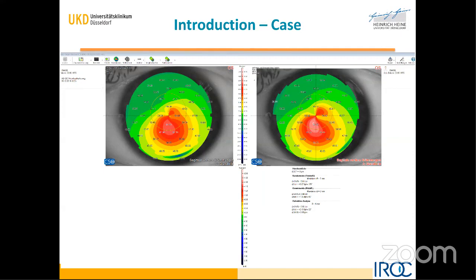So this value takes into consideration also the astigmatism. But if you change a little bit the fixation, the astigmatism changes. And you can see this on the differential map. The Gaussian map erases completely the effect of the astigmatism. And for this reason, I think that for keratoconus progression, we might take into consideration this new definition of Kmax. But we can work together on this if you like.